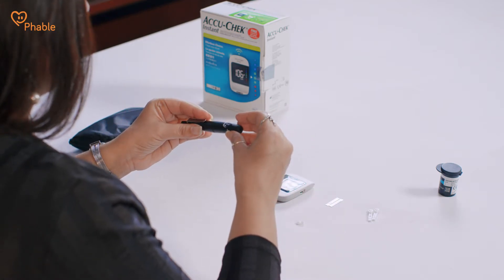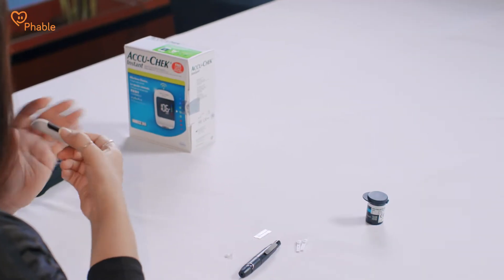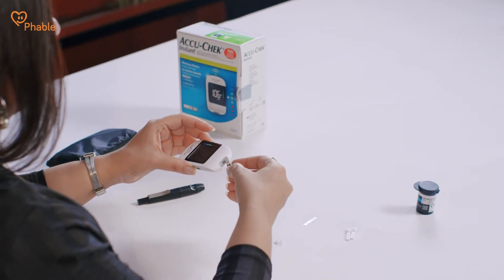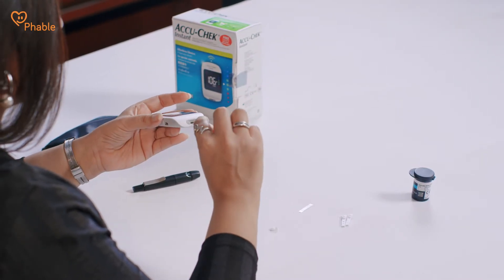Insert the cap back again until you hear a click sound. You need to press this just like how you press a ballpoint pen. Now switch on the monitoring device — press it for about 3 seconds for it to turn on. You'll now have to insert the strip provided along with the kit. Facing upwards, insert it in the slot on the monitoring device. You can see a timer now and also a drop symbol, which means the device is ready to capture the data.